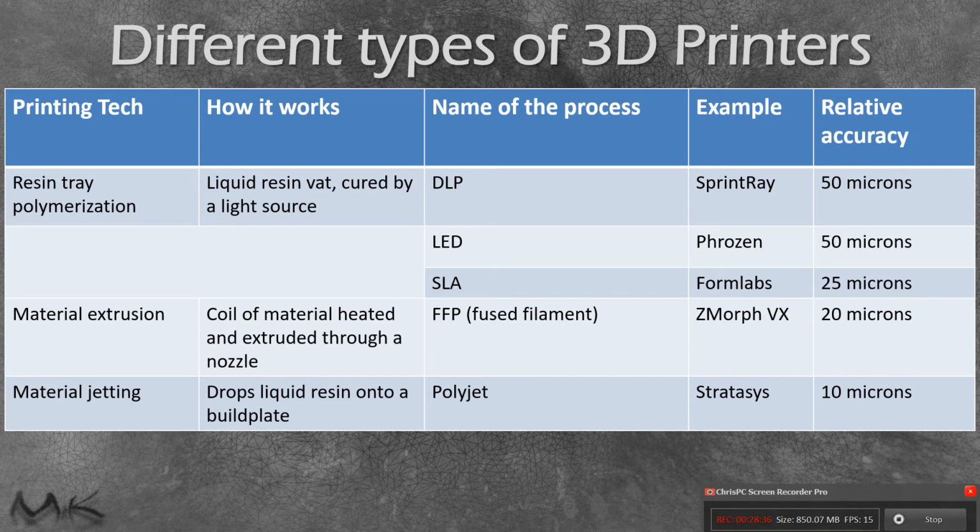Now with polyjets, the neat thing about them, and I don't talk a ton because we'd have to have a whole other lecture on introducing what's available from the dental laboratory side, but these printers have the ability to print multicolored and very complex, intricate networks. So we don't need a lot of supports because it can print unsupported areas a lot better than something like a DLP or LED printer would.